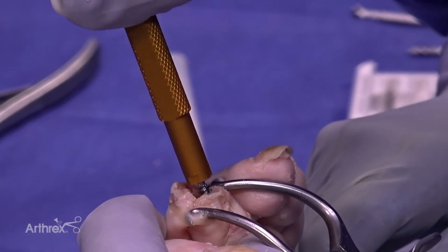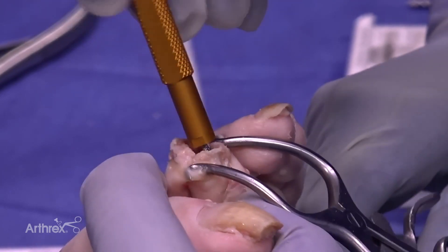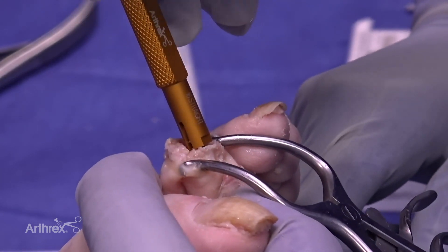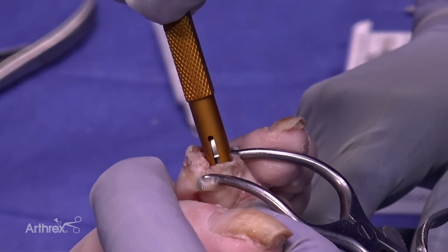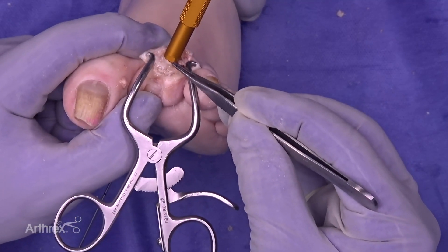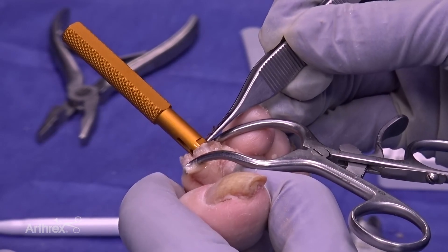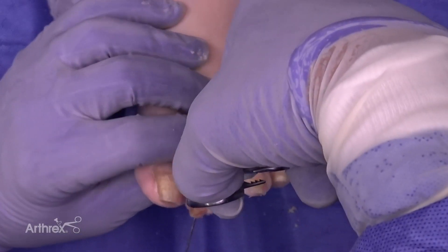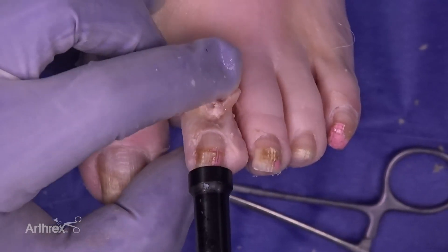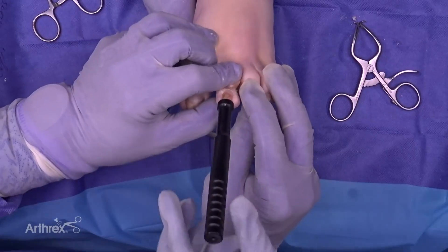Now we're going to insert the threaded portion of the Dynamite PIP implant into the middle phalanx. With this straight implant, make sure the notch is facing upwards or dorsally to ensure the implant is appropriately aligned. After inserting the prongs into the proximal phalanx, tap distally to compress the joint together.